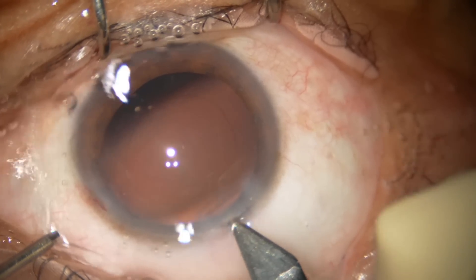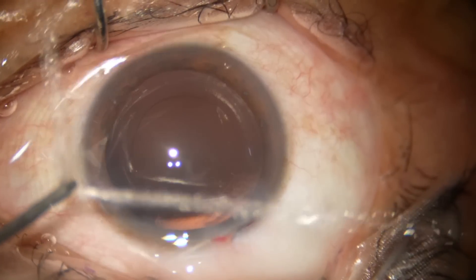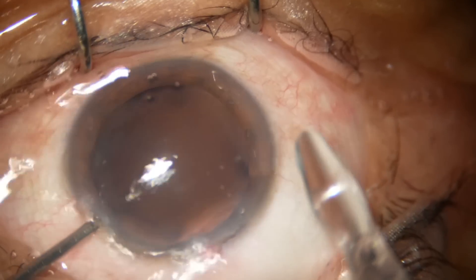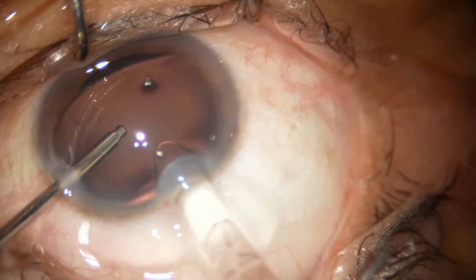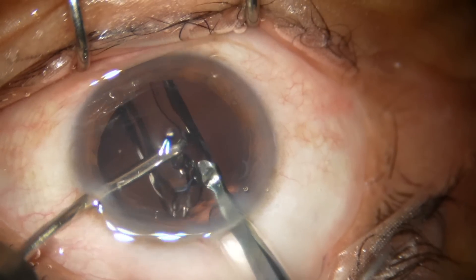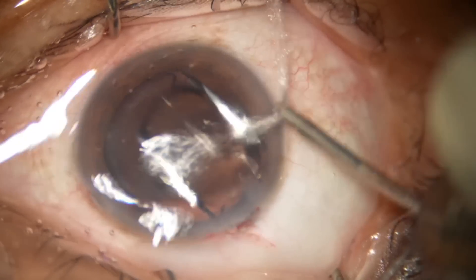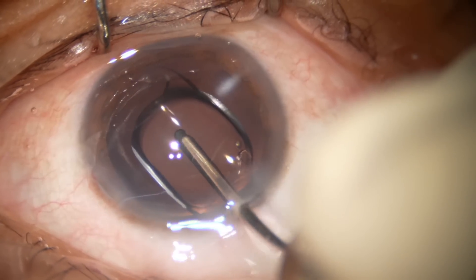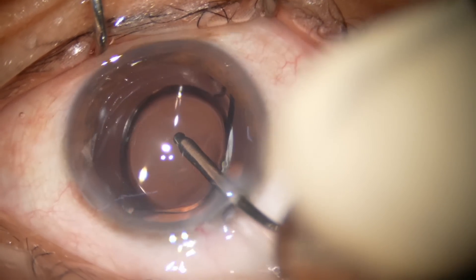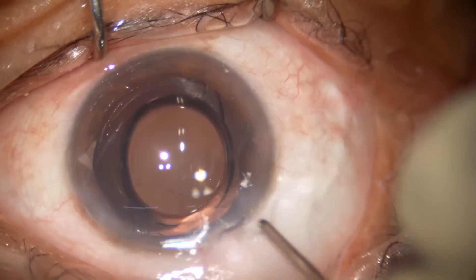I am going to use a B cartridge, enlarging the main wound just a bit. This is a single-piece monofocal aspheric intraocular lens going into the capsular bag — this is hydroimplantation, where you maintain the anterior chamber by irrigation and implant the lens. The lens is rotating because the haptics are not yet fully open; once the haptics are open it will be stable.